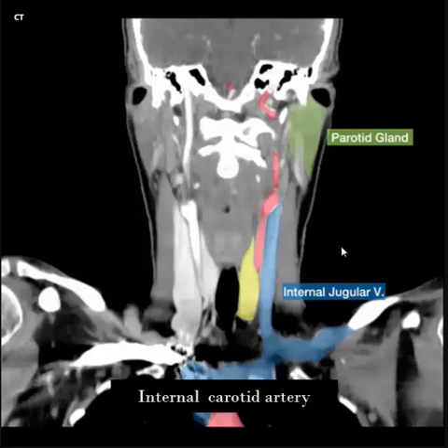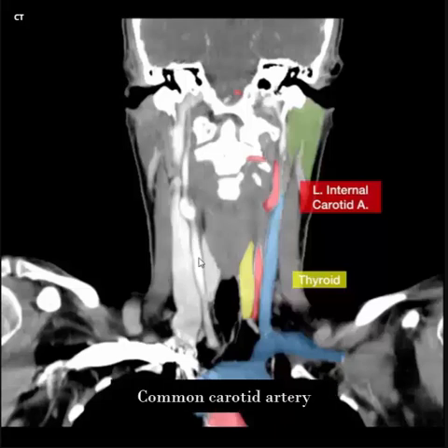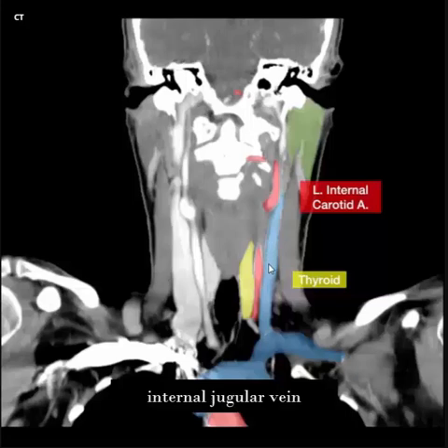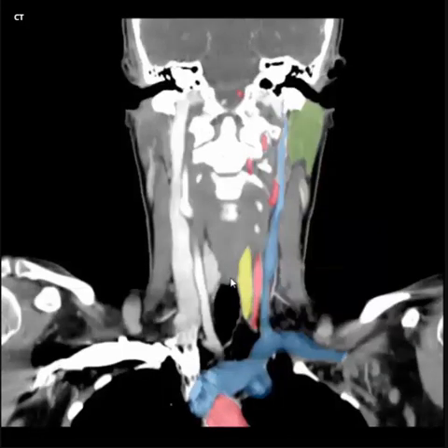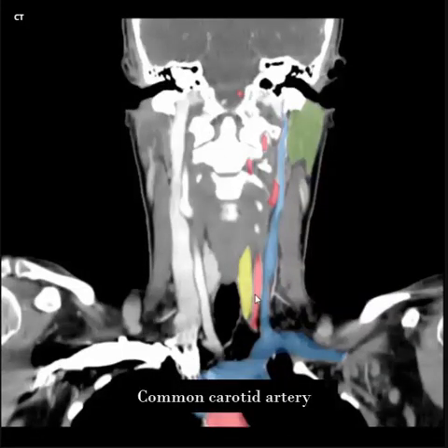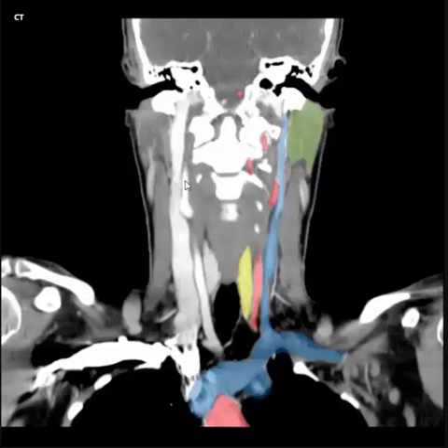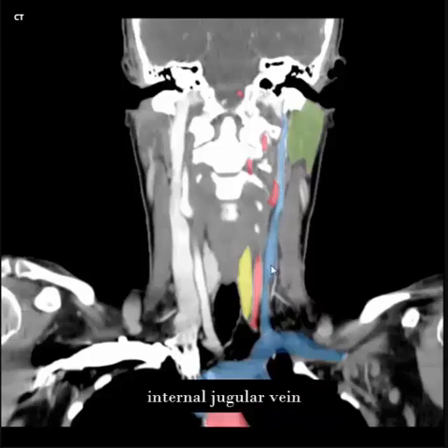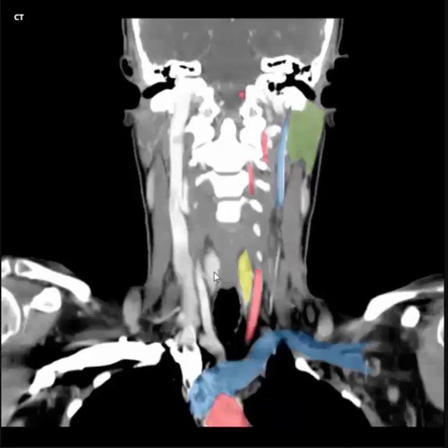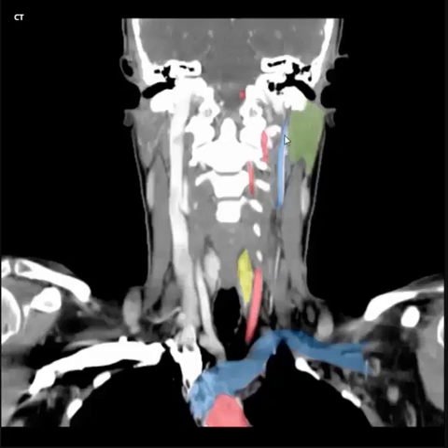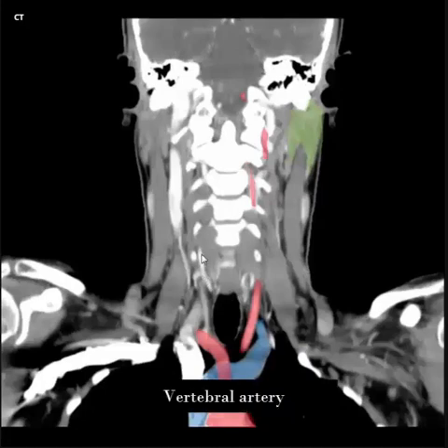Internal carotid artery. Right and left common carotid artery, right and left internal jugular vein, right and left thyroid gland. Right and left common carotid artery, internal carotid artery, internal jugular vein. Right and left common carotid artery, internal jugular vein, vertebral artery.